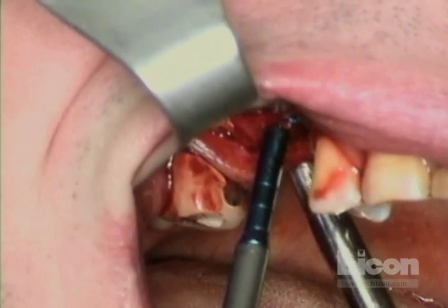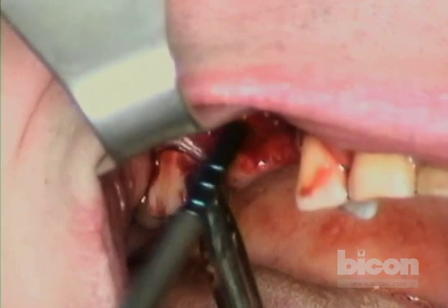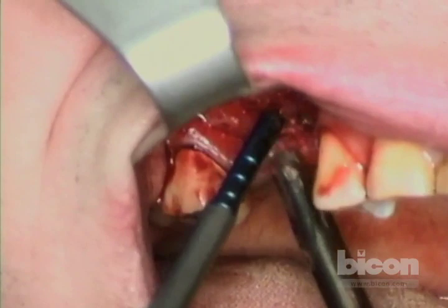For this technique, patience is absolutely essential. The patient confirms a lot of banging but is okay.